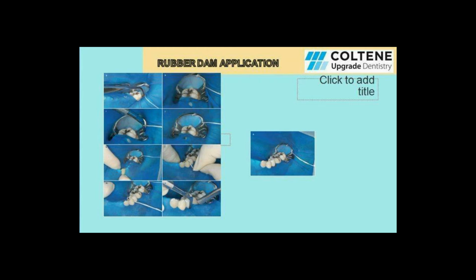The very next picture, the fifth picture, shows that we have pulled down the rubber dam sheet over the next few perforations which we made. The very next picture shows the use of dental floss. Dental floss is passed through the proximal areas or proximal contacts so that the rubber dam sheet can easily pull down through these contact areas up to the cervical margin. And the very last picture on the right hand side shows how a clamped tooth appears, and we have completed the rubber dam application method in which the whole assembly has been created outside the mouth and then put onto the tooth.